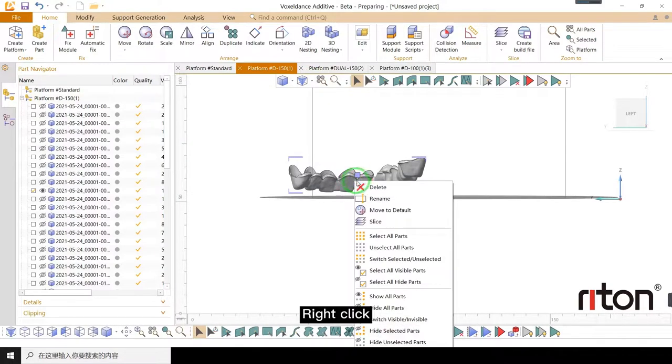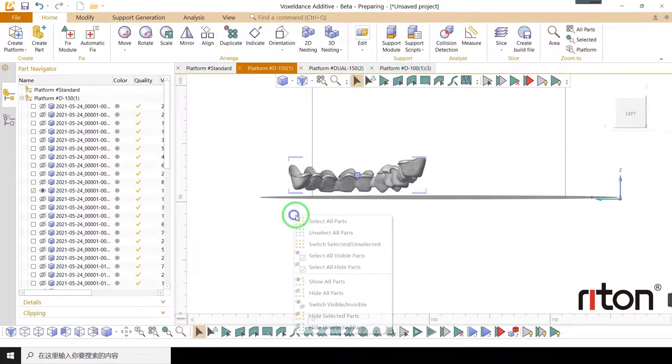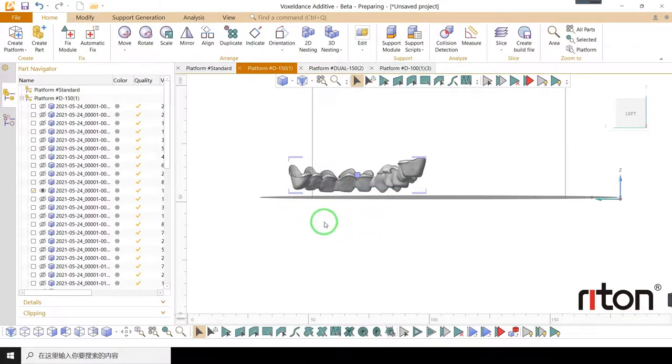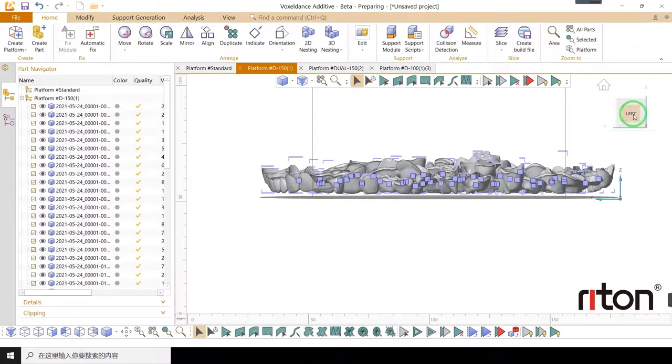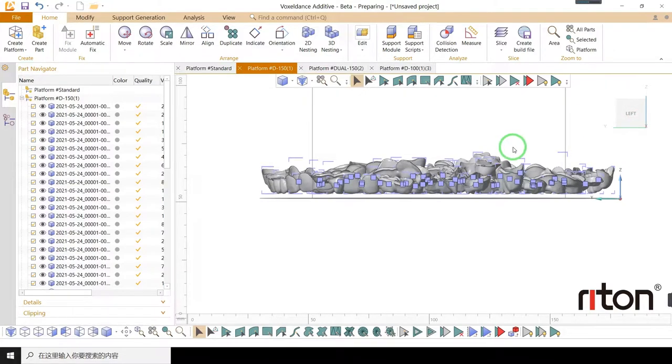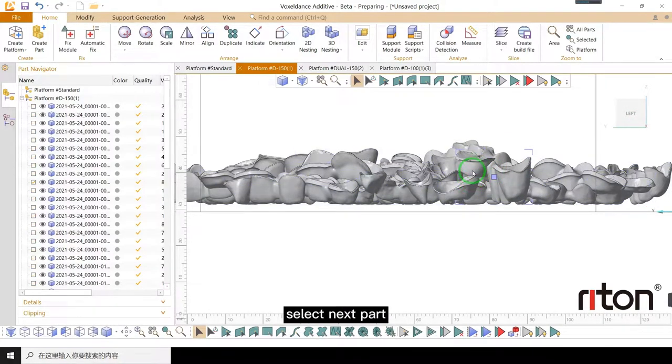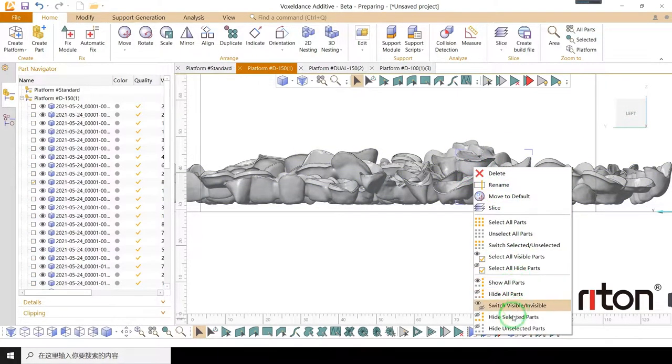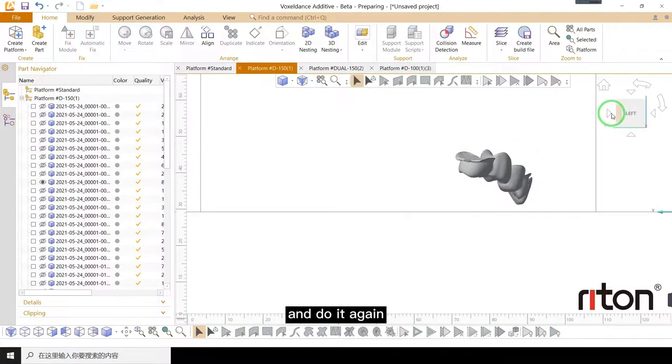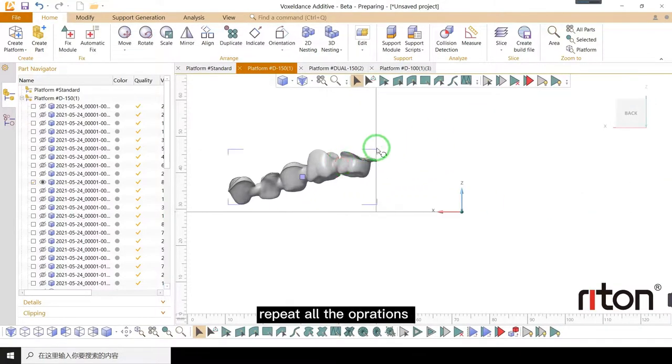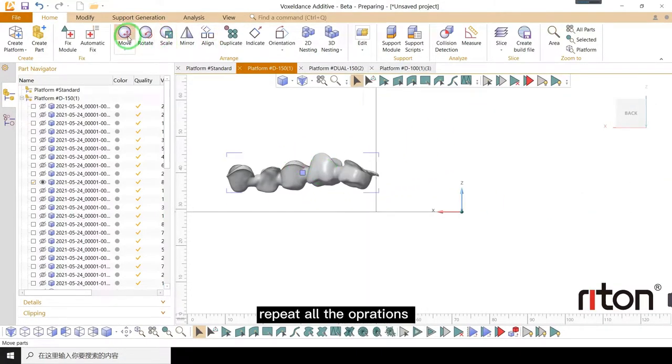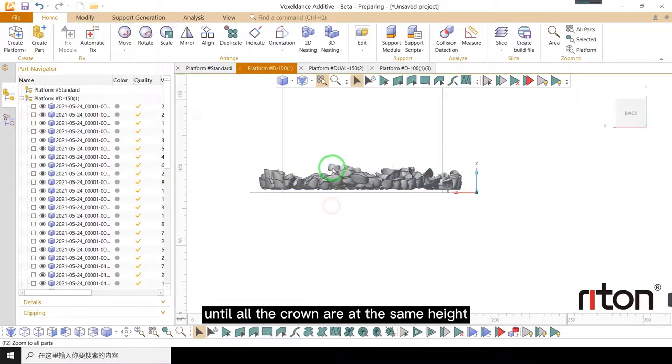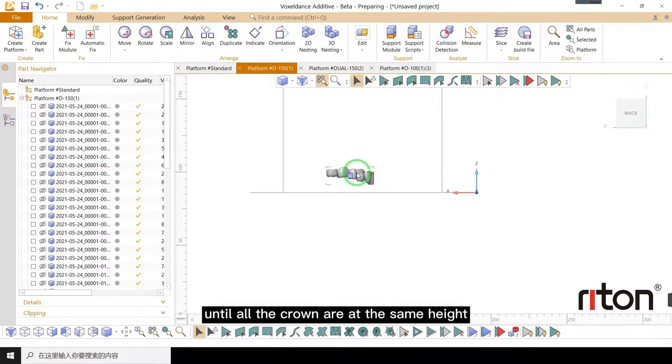Right click, show all parts. Select next part and do it again. Repeat all the operations until all the crowns are at the same height.